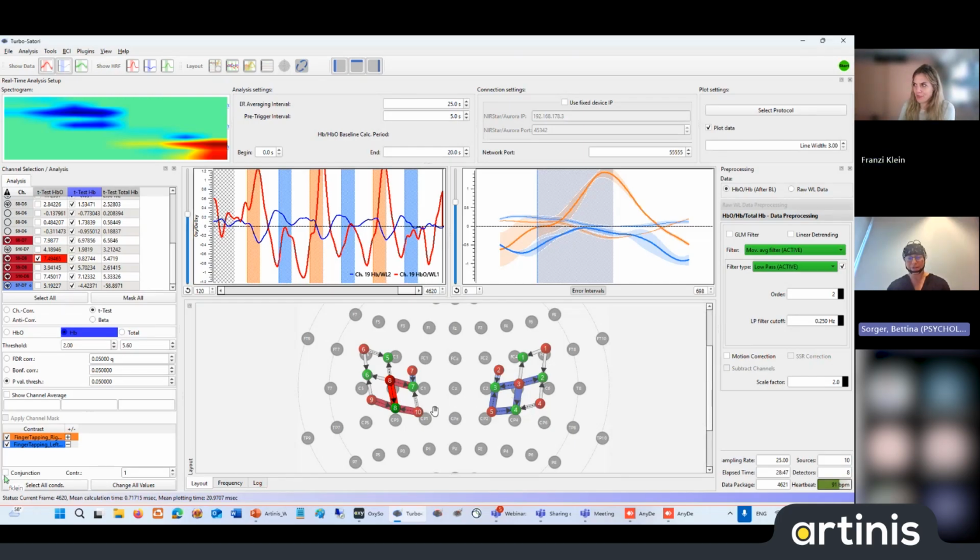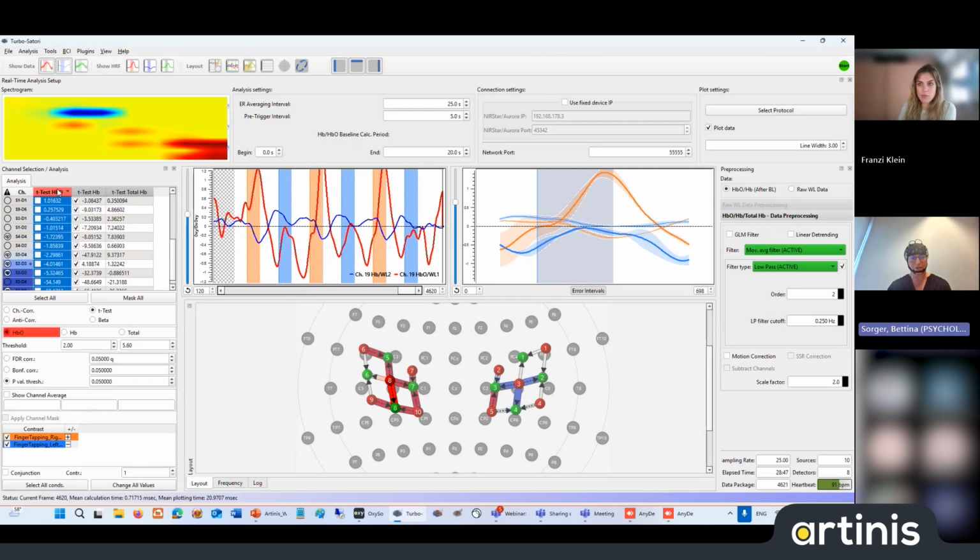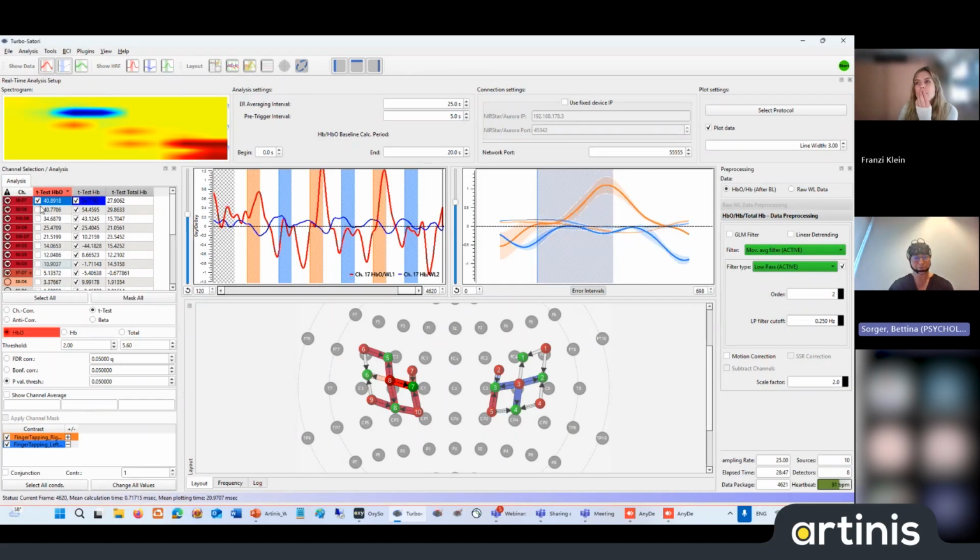So you see here really nicely for the contrast, right hand versus left hand, with just 3 trials, a huge, nice lateralization. And here, just to show you, you can go, for example, to HBO and sort the channels according to the T value. So 8.7 is actually an even better T value.